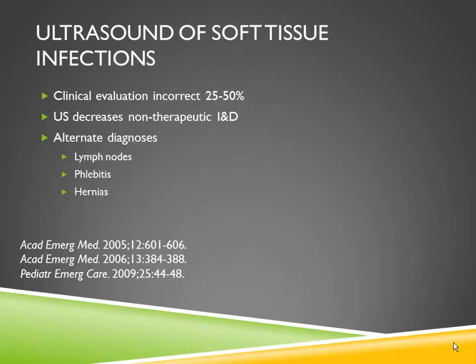and skin infections. Some of the literature would suggest that we're not as good as we would like to be with just physical exam at deciding whether there's an abscess or not. If anybody out there has ever cut into an infection and then nothing came out, you know that's true, and I'll raise my hand because I've been there. But with ultrasound, we can decrease that rate of non-therapeutic I&D. Actually, since I've started using ultrasound, I've never done a non-therapeutic I&D. Every time I cut, I get pus out now, which is nice.